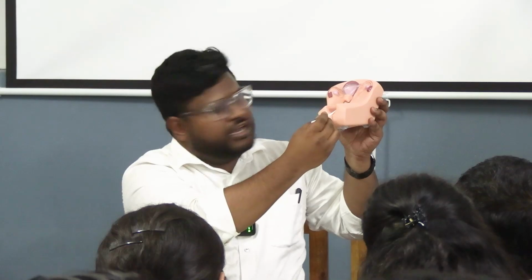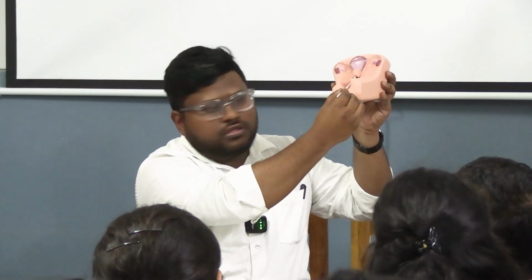Second one, into the endocervix, okay, into the endocervix, 2 to 3 rotations, take it out, smear, we're done, okay.